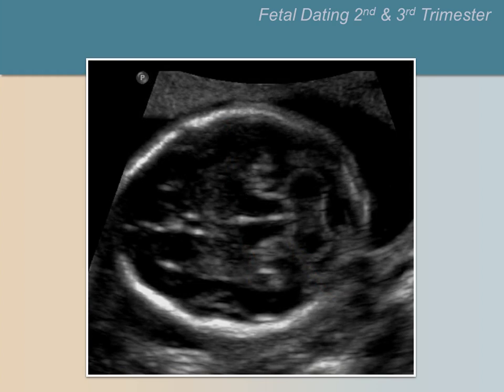Please pause the video now and ask for a participant to identify the thalamus and CSP. We have outlined the CSP and the thalamus here to make the structures more obvious.